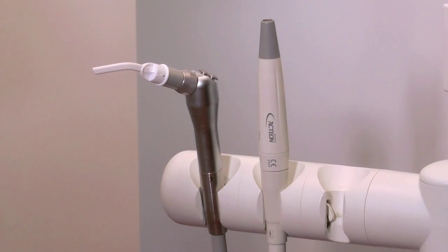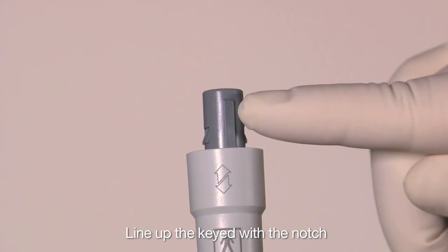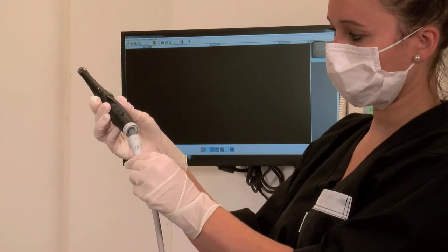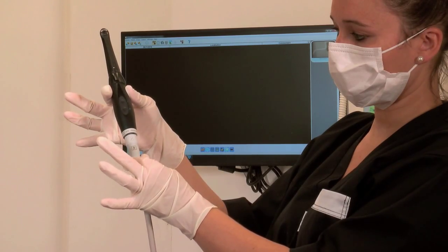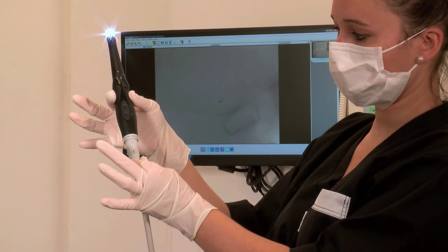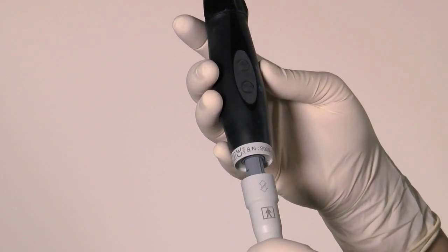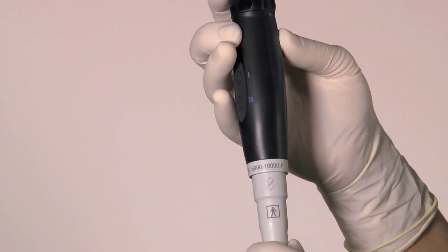Identify the elevated plastic section on the cable connector and line it up with the notch located on the camera handpiece. Gently connect the camera handpiece to the docking station cable. Do not force the camera handpiece onto the cable. The camera handpiece should connect to the cable with little effort.